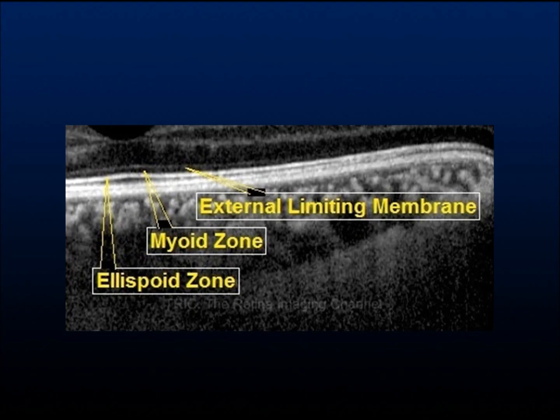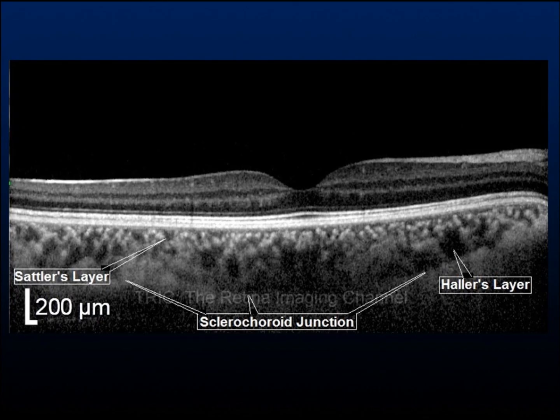The external limiting membrane, myoid zone, and ellipsoid zone are shown in this blown-out image. The enhanced depth imaging allows us to image beyond the RPE as seen in this picture. The sclerochoroid junction, large vessel layer or Haller's layer, and medium vessel layer or Sattler's layer can be visualized with enhanced depth imaging.